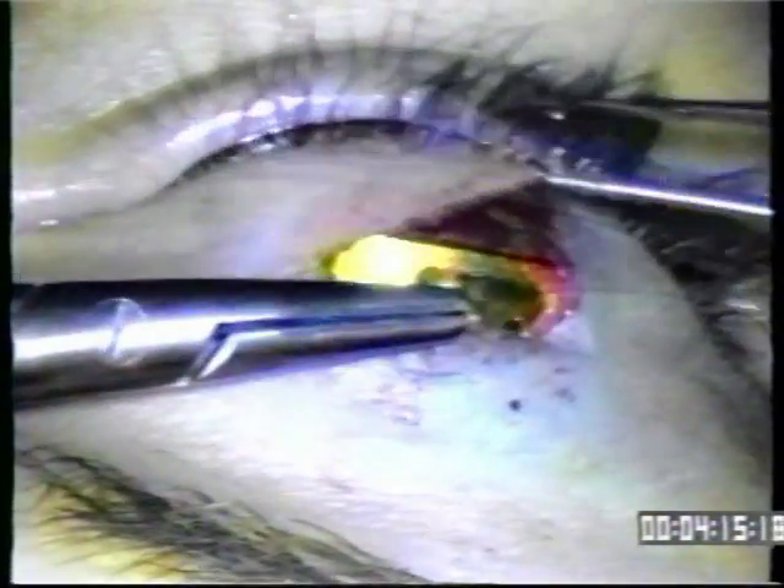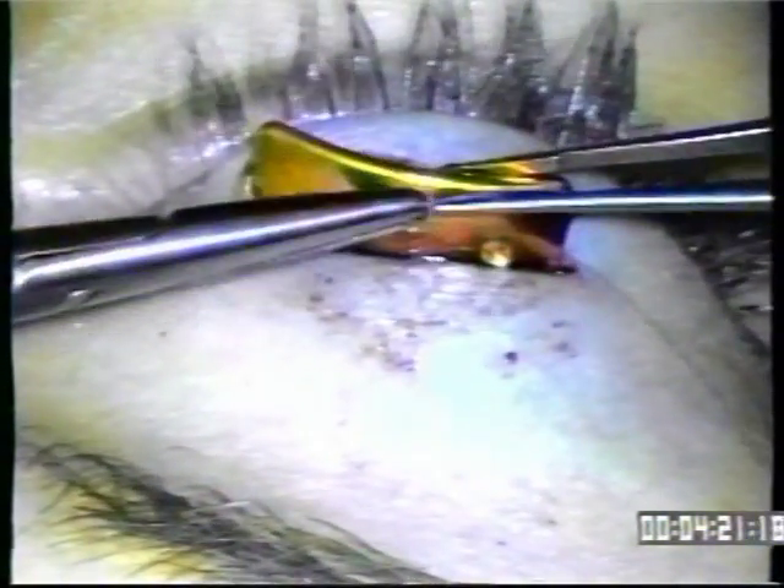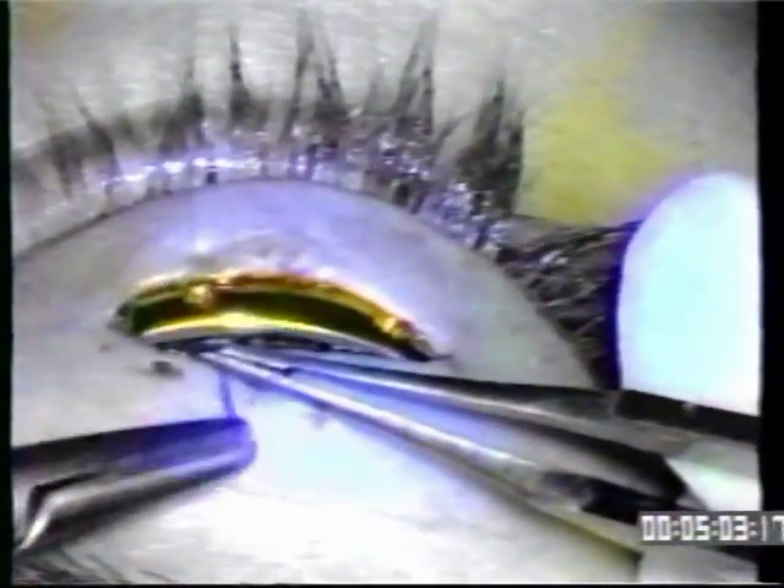The first step is to suture the gold to the lower portion of the pocket. The suture goes through the gold and through the connective tissue between the lid and the tarsus. The suture is tied with five throws because 8-O ethilon tends to unravel if you don't put at least five throws in it. It's very important not to skip suturing the gold — it looks like it will fit well if you just close the wound, but we found that was a mistake. Without suturing, the gold tends to rotate, migrate, flip over, and extrude.